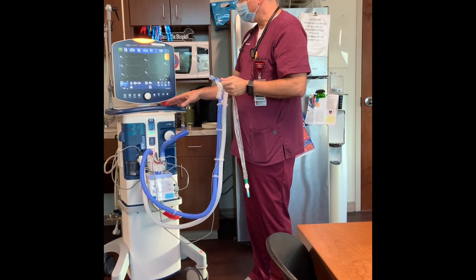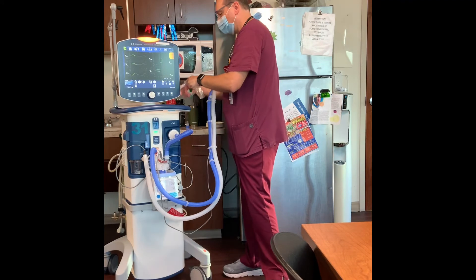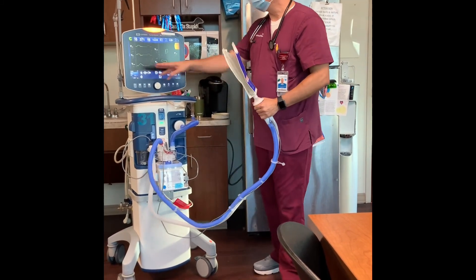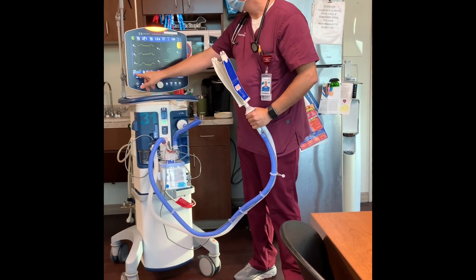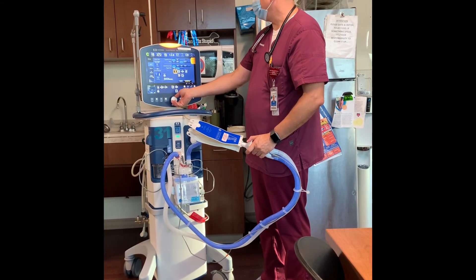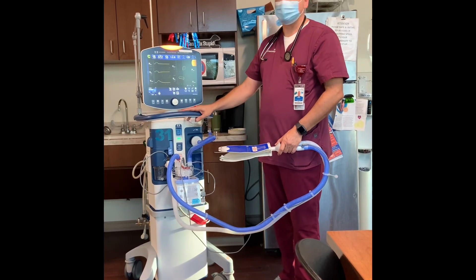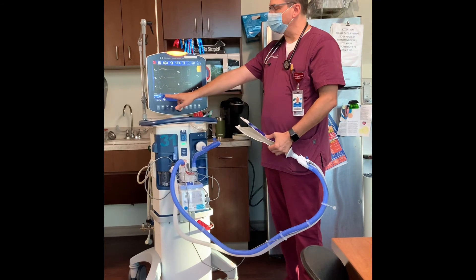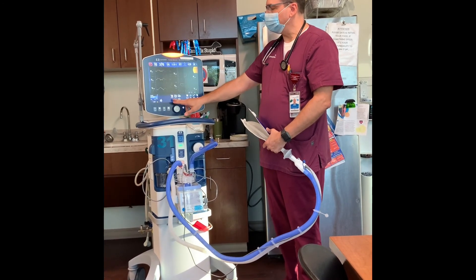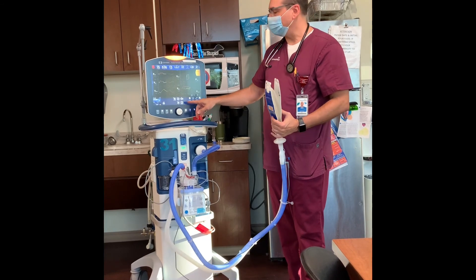After suctioning, you can turn the valve back off and leave the catheter in place on the patient. Now, the other common mode you would see is the spontaneous pressure support mode. This is where the patient is breathing on their own and we're giving them just a little bit of support. In spontaneous mode, there's no set rate and no set tidal volume — the patient is totally doing this on their own. All we're providing is some pressure to overcome the resistance of all the tubing, along with oxygen and PEEP.